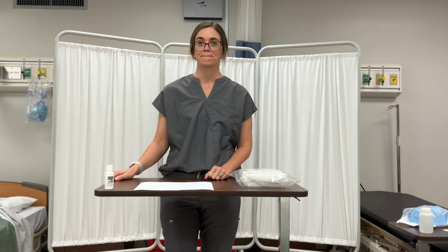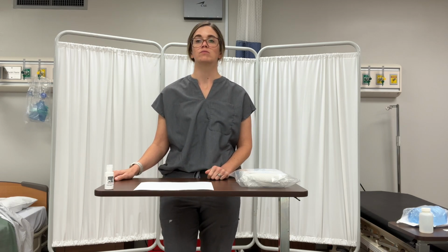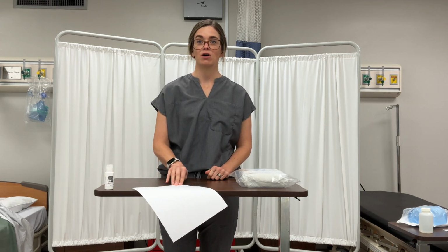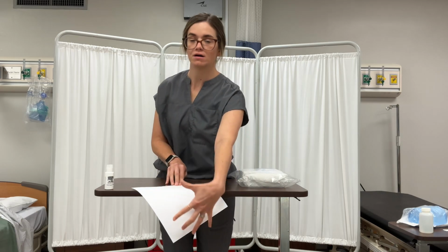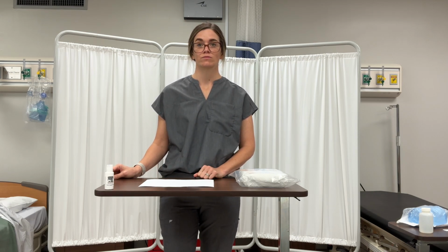Tables draped as part of a sterile field are considered sterile only at table level. So if my sterile field goes off the table, all of this off the table is no longer sterile. If there is any question or doubt about the sterility of an item, the item is considered to be unsterile.